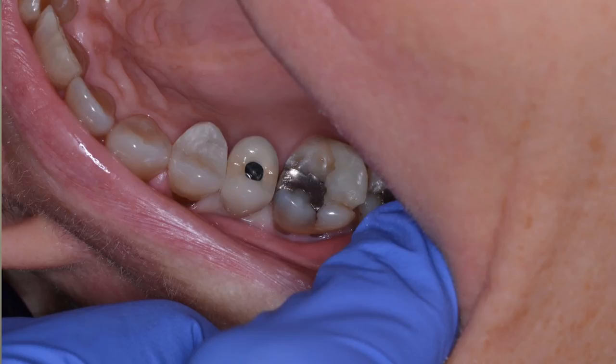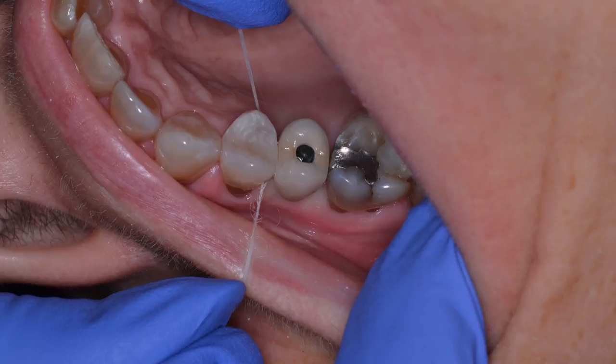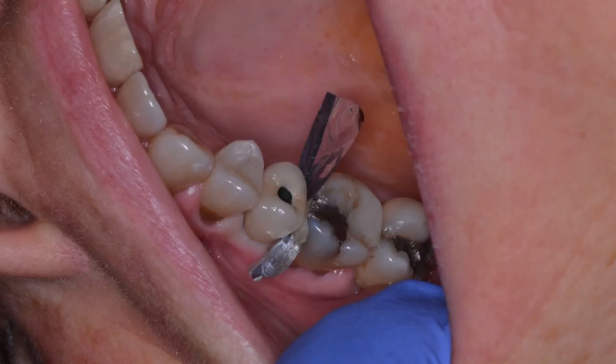One method is taking a piece of floss and assessing the passivity of the contact. The second way is to use something like a piece of shim stock. If this is going to be a passive fit, you should be able to move the shim stock very easily. As we'll show you in the video, put the shim stock in, put the screw retained crown in, torque it in, and then the shim stock should move out.